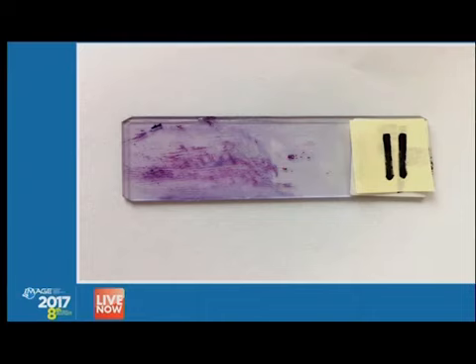I just want to show you the slides of the biopsy that we took yesterday, because we had a very good result, not for the patient but for the diagnosis. This is the first slide with staining with hematoxylin and eosin, and you can see the material on the smear. This is what we smear. If you see here how we treated the material, this is not the specimen that we put into formalin, but this part. So we prepare two slides, and this is the result.